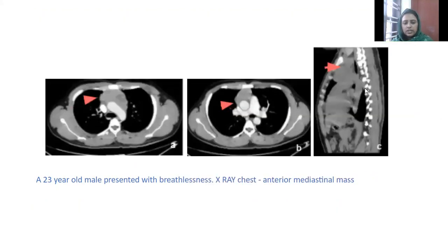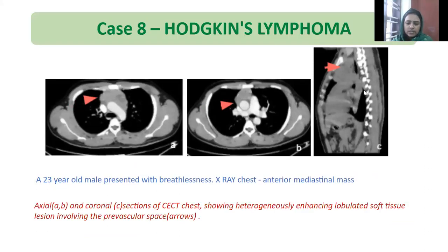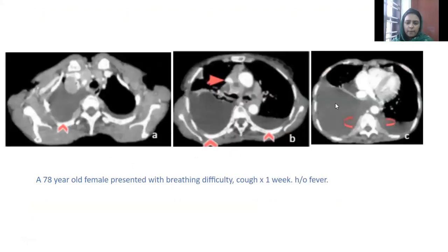Next case: a 23-year-old male who presented with breathlessness. X-ray showing anterior mediastinal mass. Axial and coronal CT chest images showing heterogeneously enhancing lobulated soft tissue lesion involving the pre-vascular space. Biopsy came as Hodgkin's lymphoma.